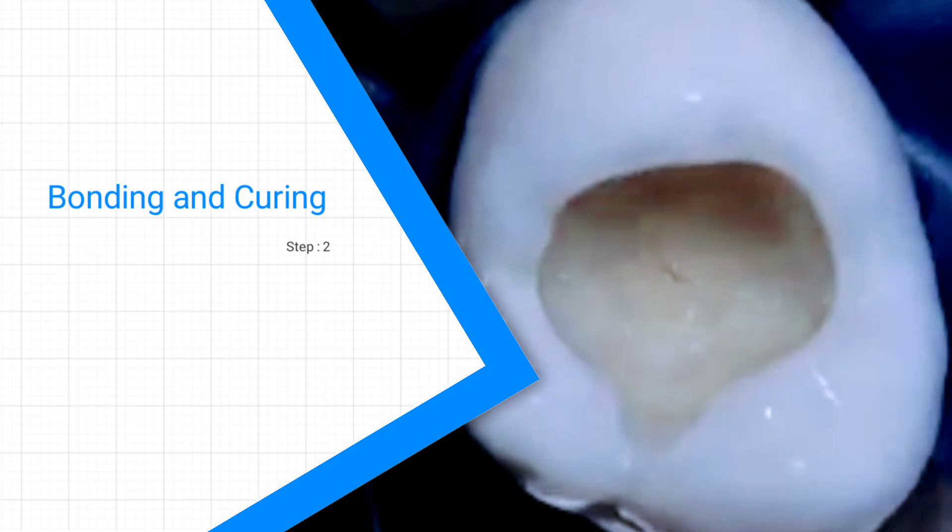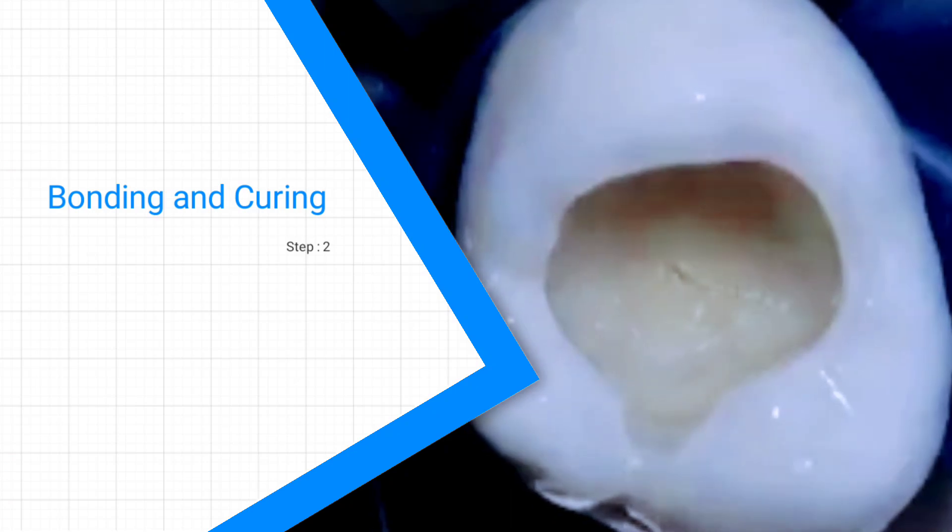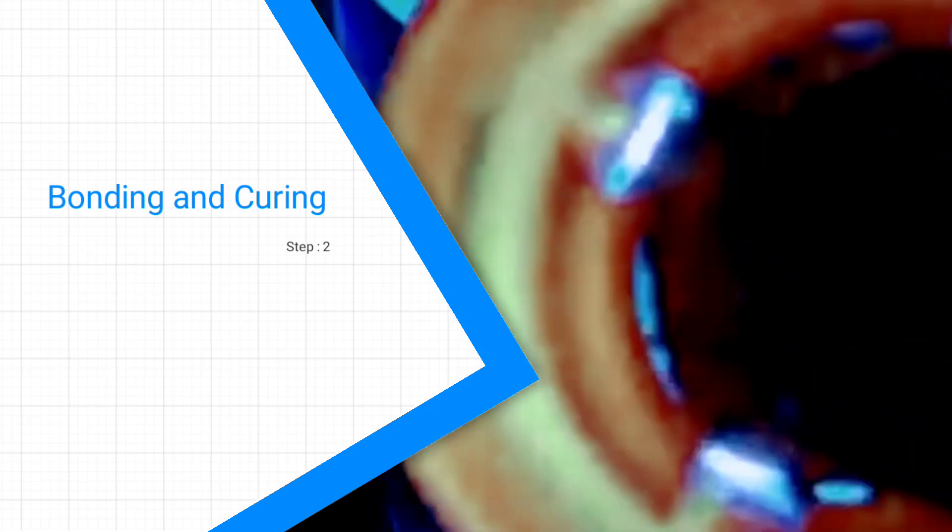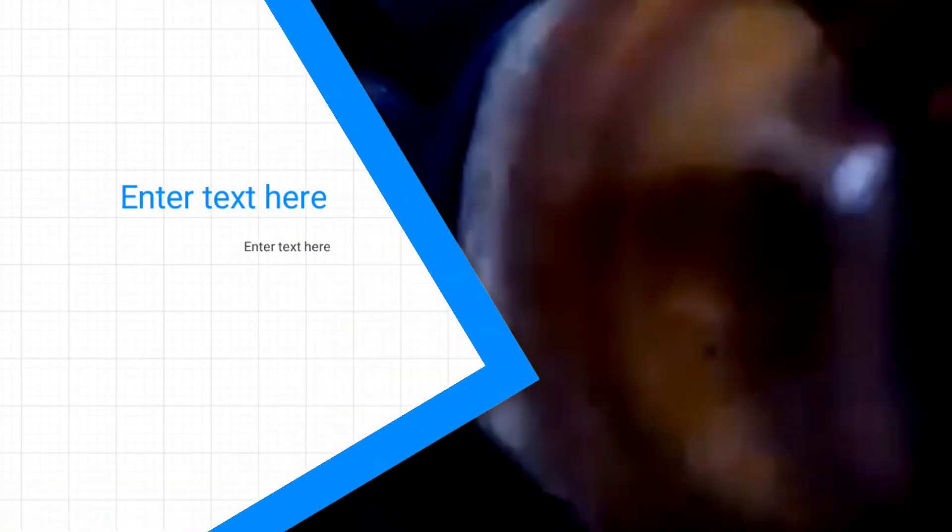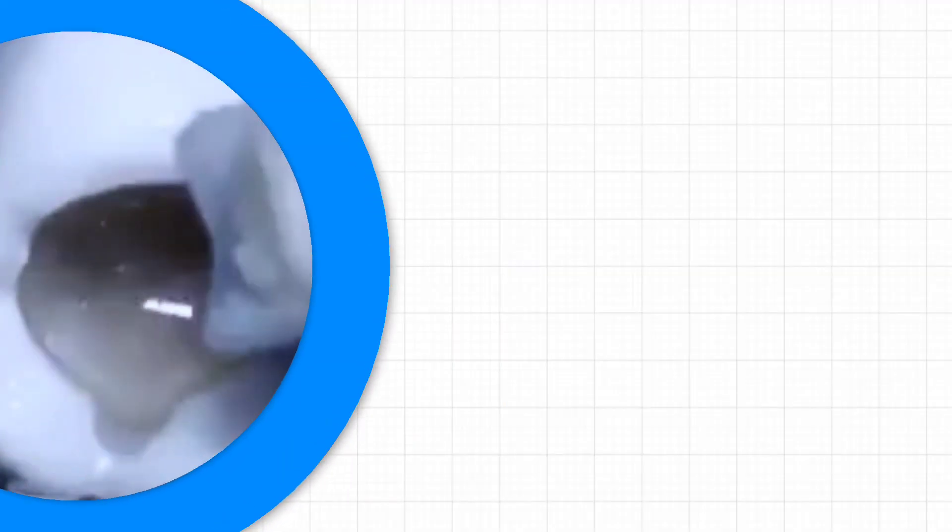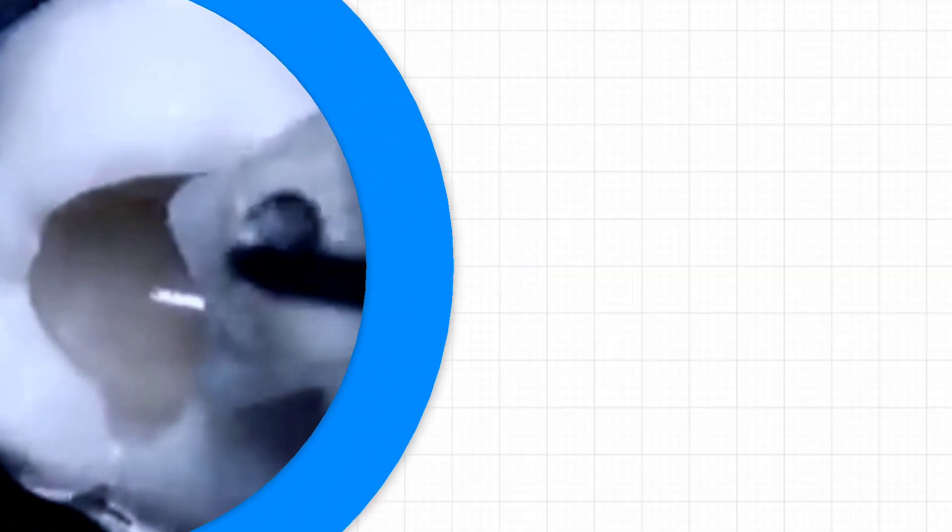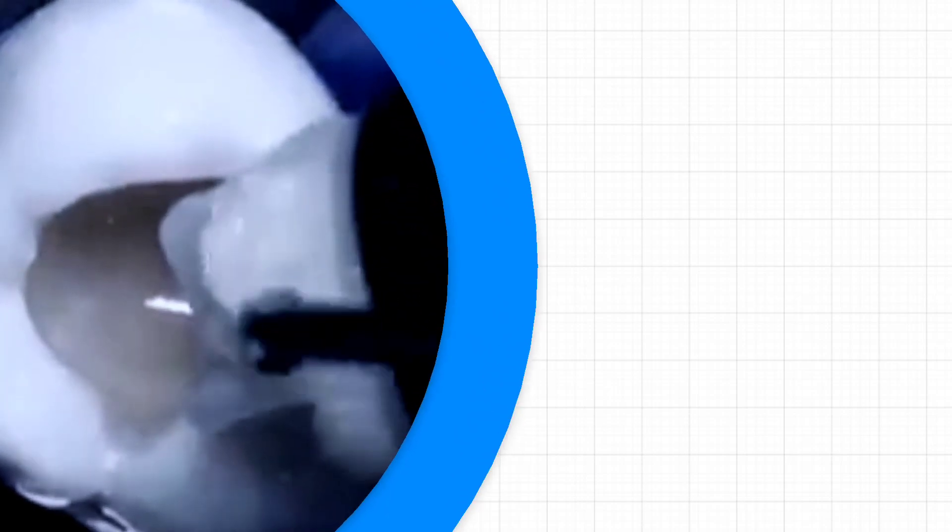Once the bonding agent is even on the dental surface, you can expose it to the curing light for about 15 to 20 seconds. This light triggers the catalyst in the bonding agent and causes it to harden, establishing a micromechanical bond with the etched surface.